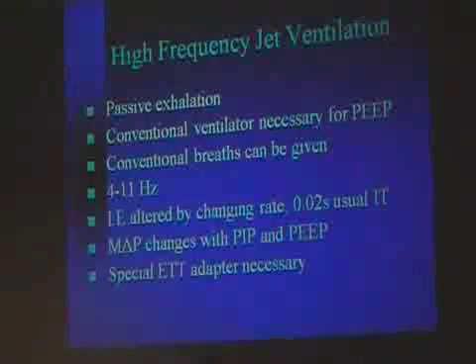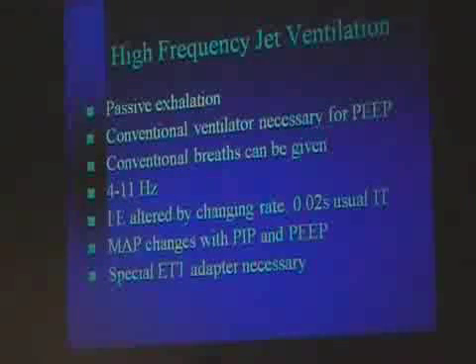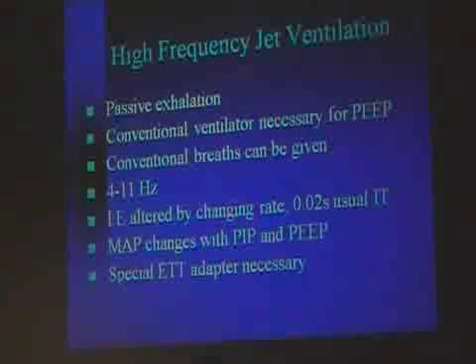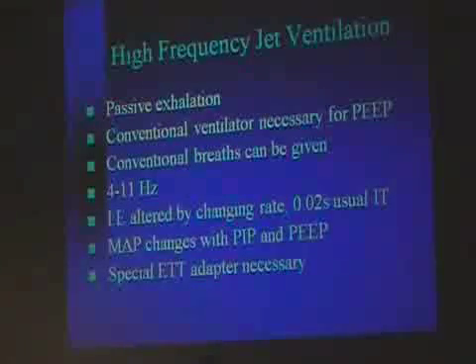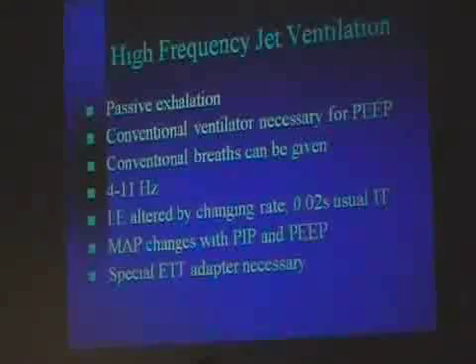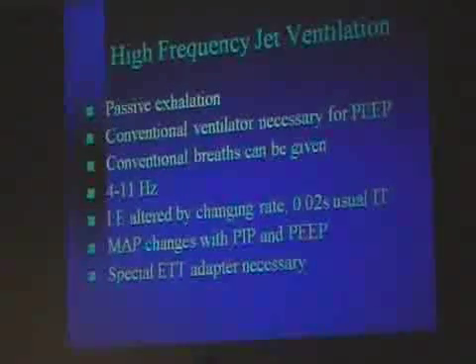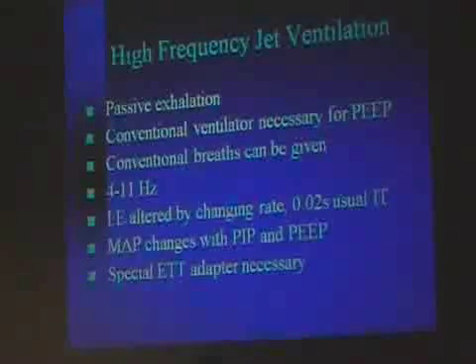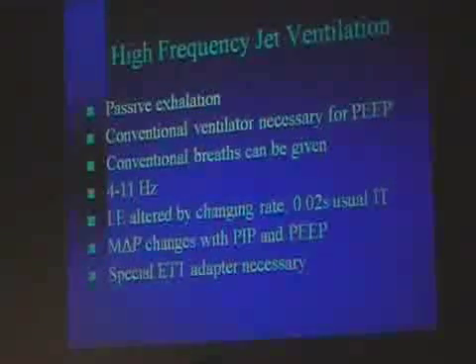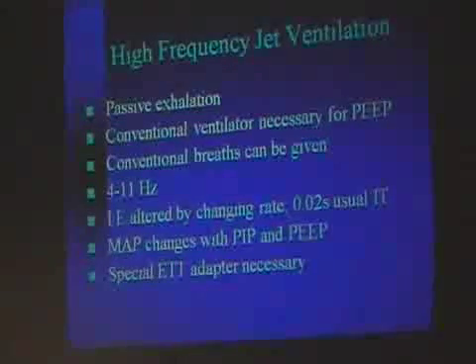At the current time, there is not a recommendation for changing the inspiratory time. There's some work going on, predominantly in Jay Pillow's lab, looking at whether or not under some circumstances having a longer inspiratory time with the jet might be useful. But at the current time, without good data, I would highly recommend that we leave the inspiratory time where the manufacturer recommends it, and that is the 0.02 seconds.